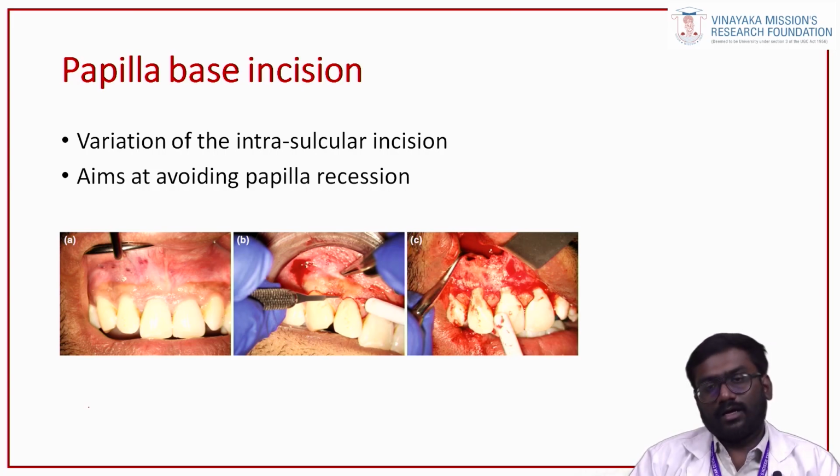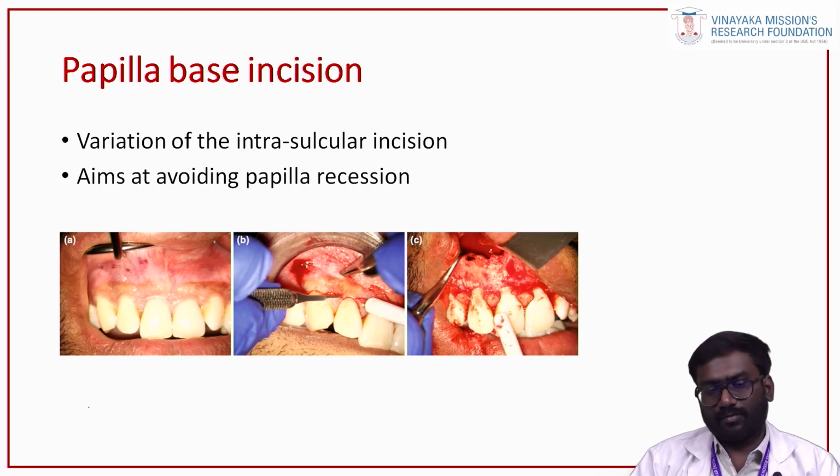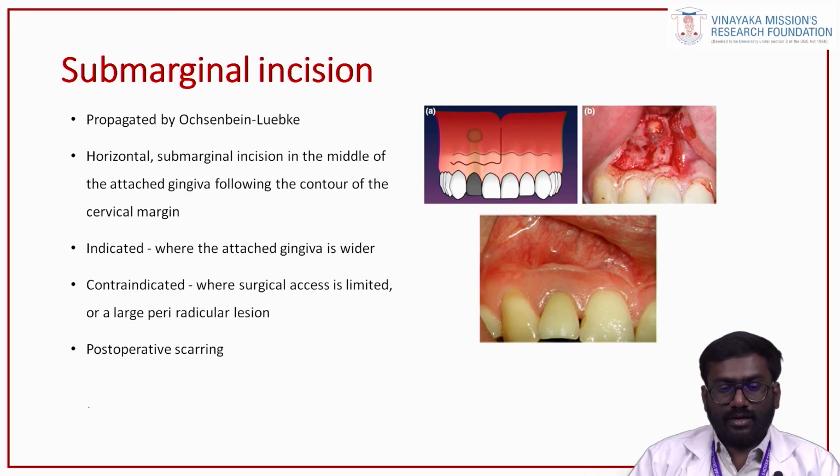So in the papilla, instead of creating a sulcular incision, we cut the crevice, and in the papilla we make a horizontal incision. In that way, the recession and the papillary detachment can be prevented, but it is again technique sensitive and not widely practiced.